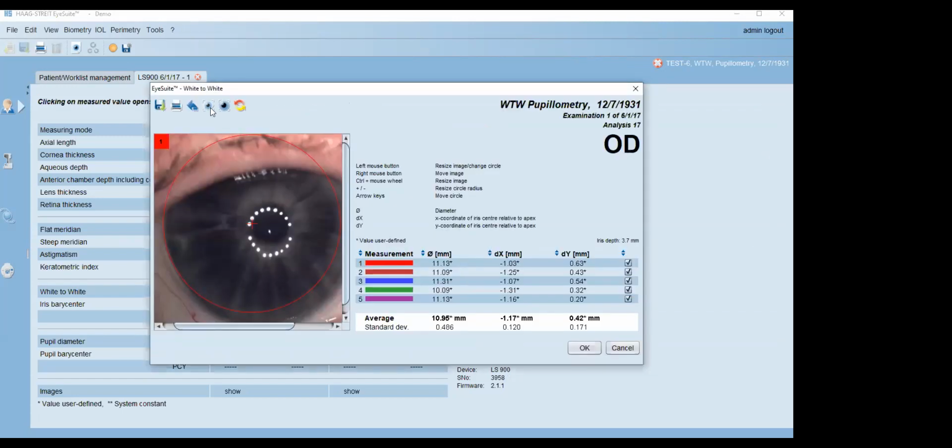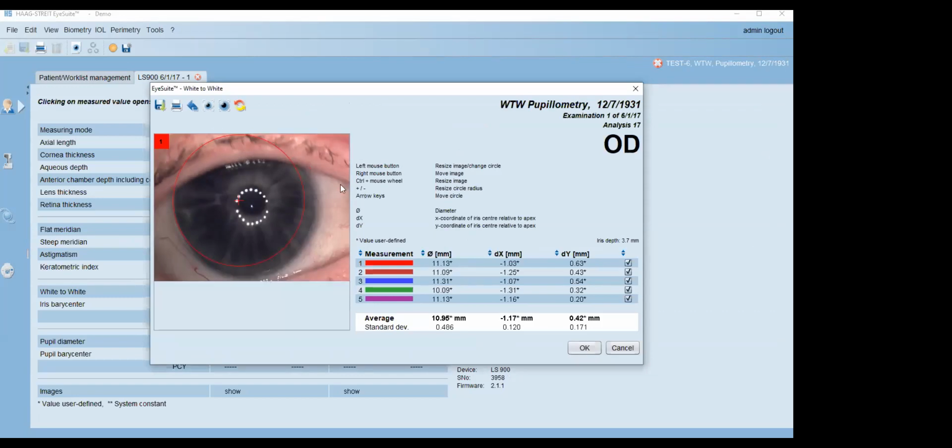And what you'll typically find is if you have a very light iris, or maybe a scar or pterygium coming up over the iris and fading it out, these calipers are programmed in the software to find dark to dark surface. So if the iris is faded out, it doesn't know any better but to place itself on that dark area.